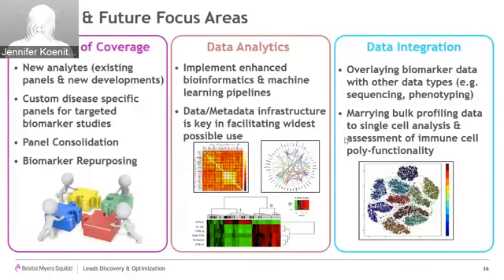We also have a growing need for custom disease-specific panels to support targeted biomarker studies. And we also are always very interested in trying to consolidate and merge individual panels wherever possible to both reduce workloads and the volumes of sample that are needed.